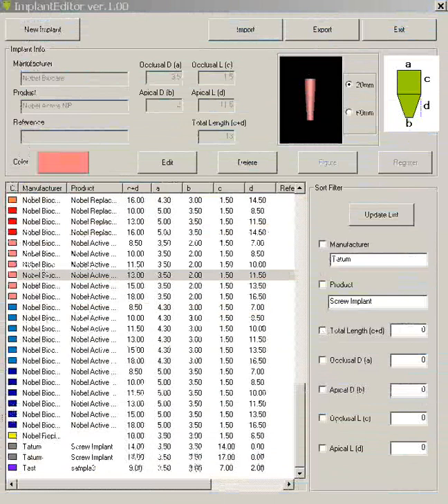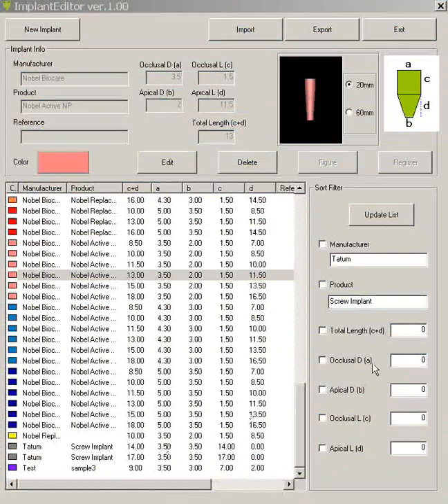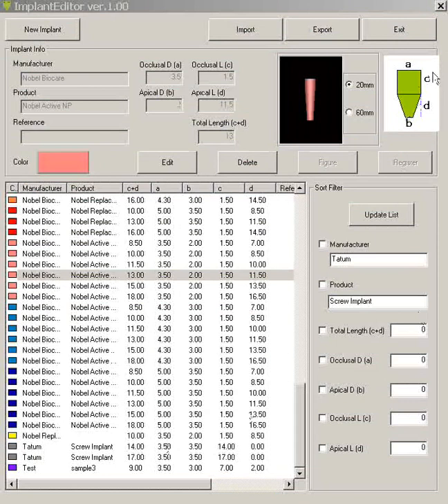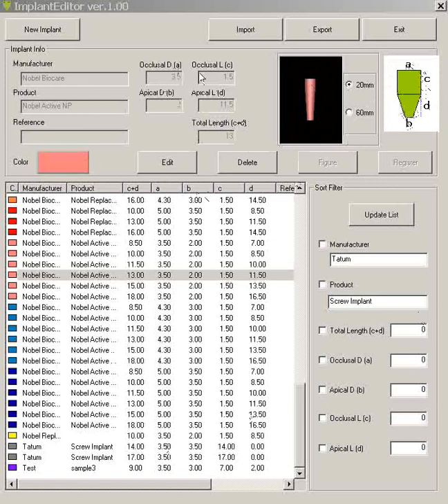Now before we register a particular implant just for practice let's look at the dimensions. Let's start here with our little green figure in the upper right hand corner. We have three places for these columns. First of all A represents the occlusal diameter. So here's the column occlusal diameter. And also here, here's the occlusal diameter here where you can register it.